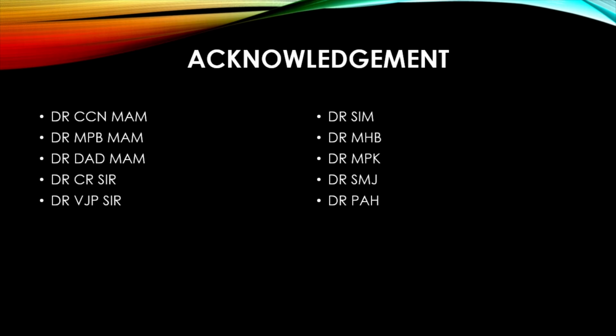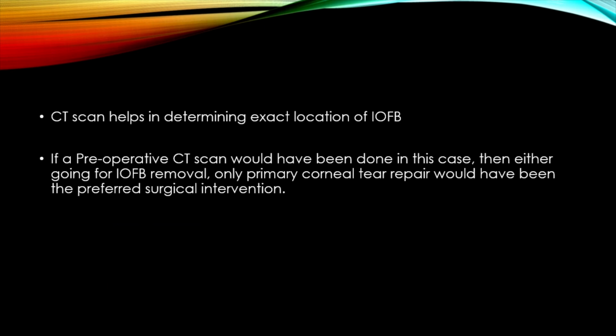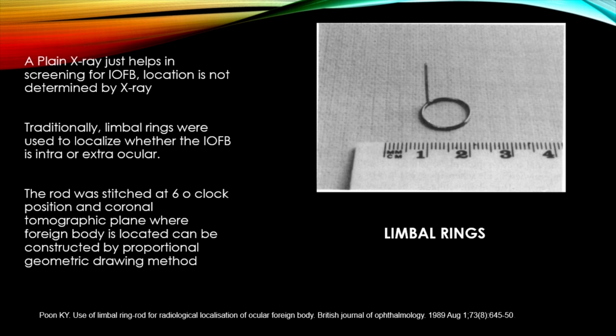One point I wanted to make is that you said to go through the slides once from the beginning. Regarding your limbal ring, let me talk briefly, because I am the oldest man in Sankara Nethralaya, so I can tell you that I have used the limbal ring. Nobody uses the limbal ring now, but if you want to know about it, basically it is sutured to the limbus at 6 o'clock. But in lieu of the limbal ring, you can also use a contact lens with radio-opaque spots at 4 points, 6, 12, 3, and 9 o'clock. Place the contact lens and take an X-ray as well.